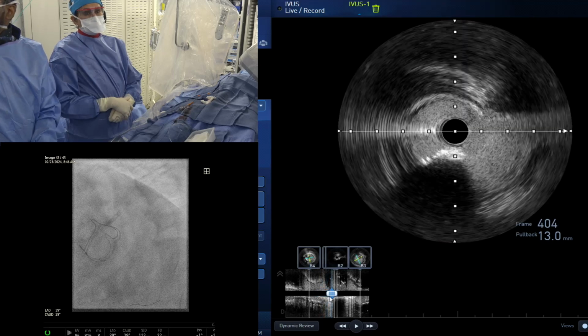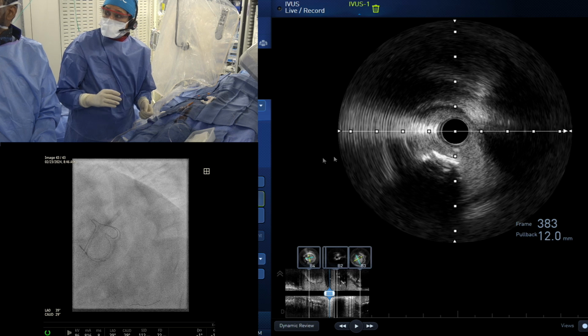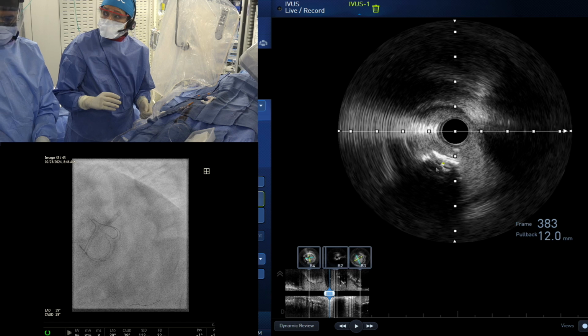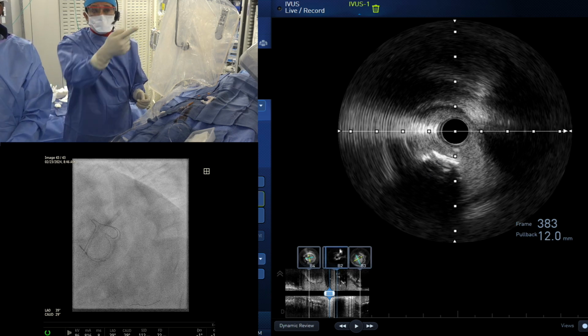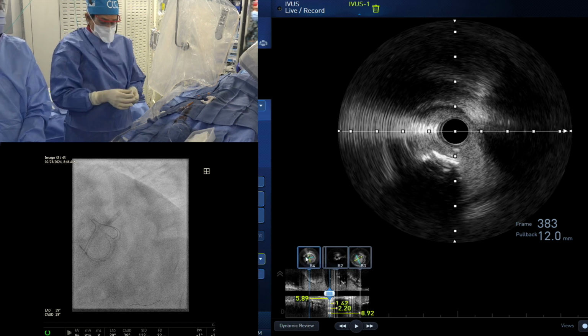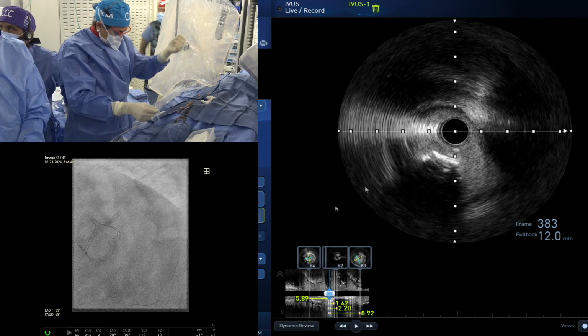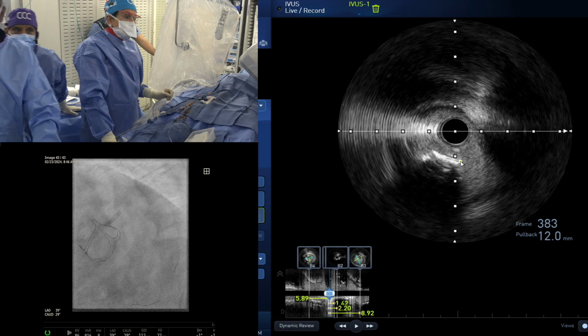Now guys, can we bring the screen a little away so we can also see the side pictures? This is the ostial circ. You see at 6 o'clock, this is the calcified nodule protruding inside. If you look at the diameter of the lumen, do you think a 1.5 burr is going to touch that nodule or is it just going to pass through? Because you see on your IVUS, everything went so smoothly.